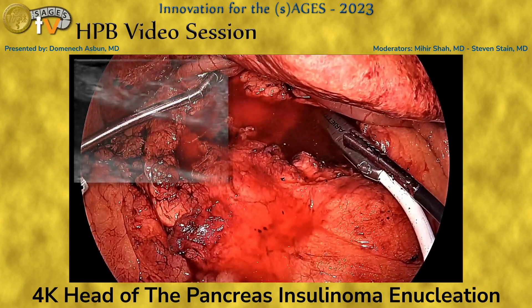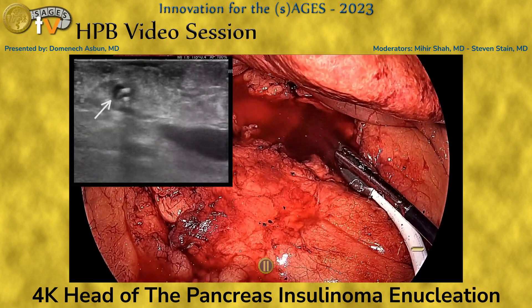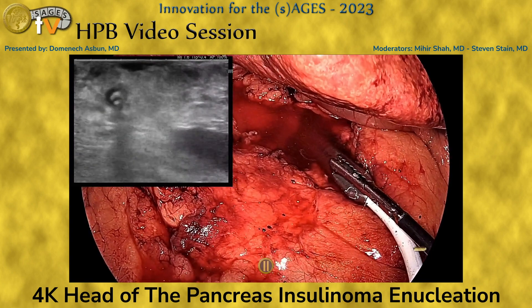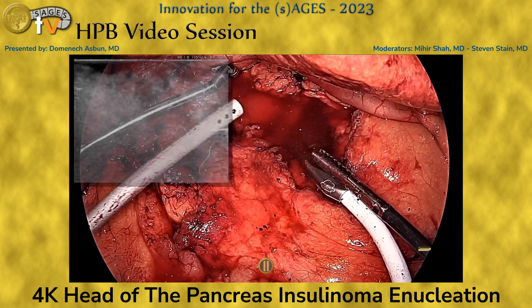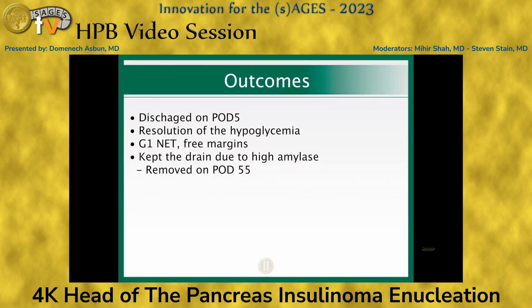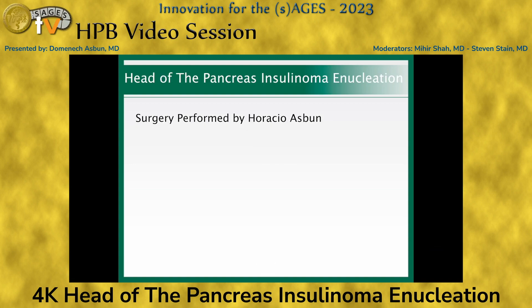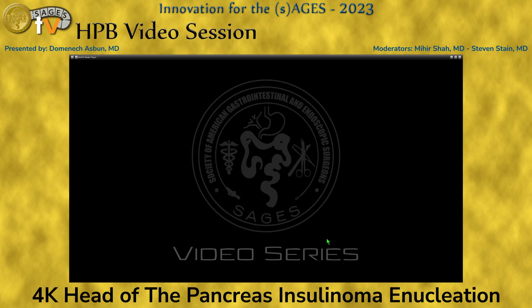Hemostasis is confirmed. We use ultrasound to evaluate the resection cavity — you can see the pancreatic duct with the stent in place, which is relatively far from the resection cavity. We leave a drain because of the high incidence of pancreatic leaks after this procedure. The patient went home on postoperative day five with resolution of his hypoglycemia. As expected, he did have a pancreatic leak that became a type B post-pancreatectomy fistula, but the patient was happy to have avoided a Whipple.